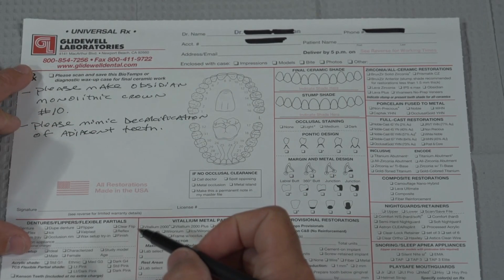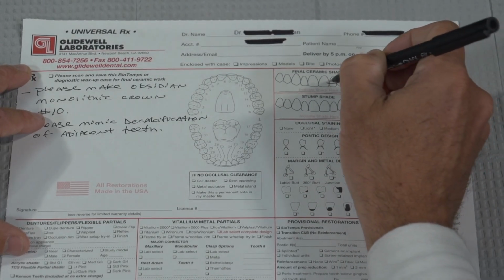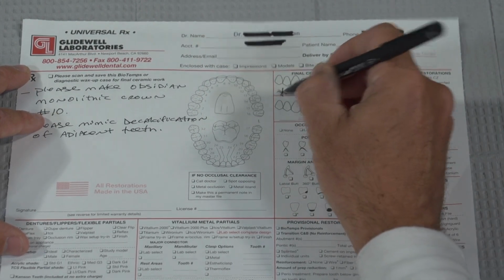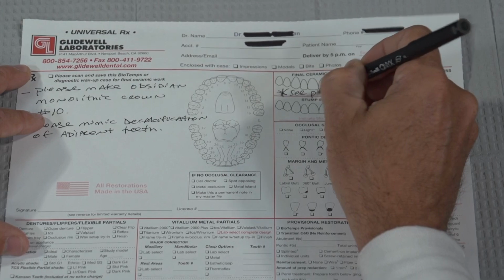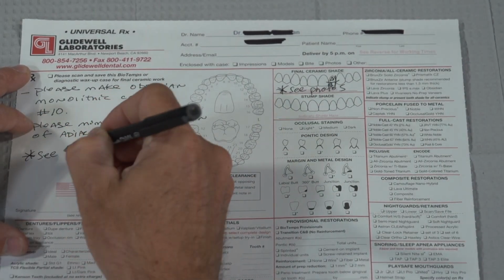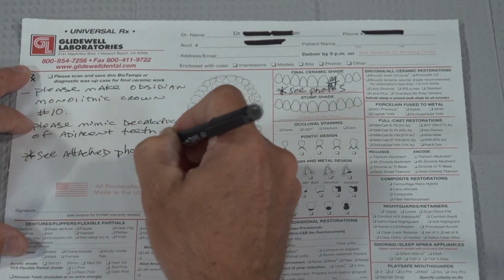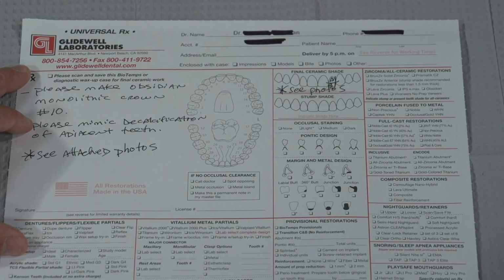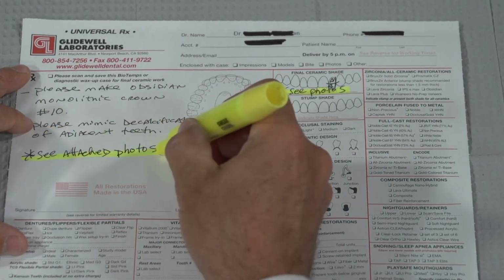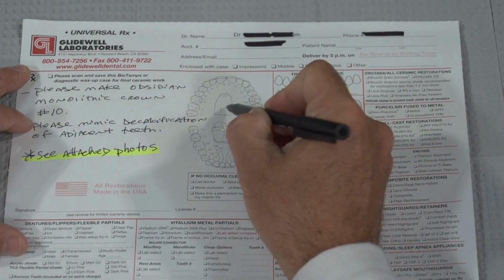Moving on to the RX form, it is important that exact details about the shade are presented here. To start, leave a space and write "See attached photos." Plus, highlight that area if you need to. In the space provided on the form to write the shade, it's helpful to notate the shade as well as the guide you acquired the shade from. Getting into this habit will be especially helpful when you're using a bleaching guide. This is due to the large number of bleaching guides available to choose from, but also when using plastic denture tooth shade guides or less popular guide brands.